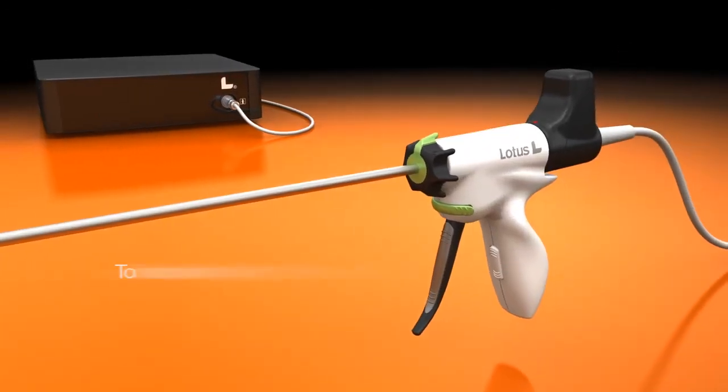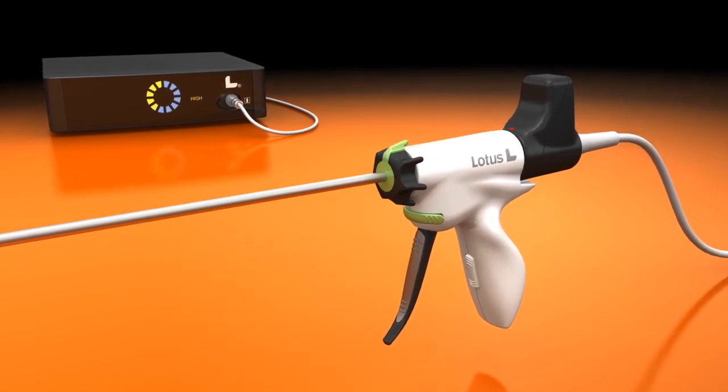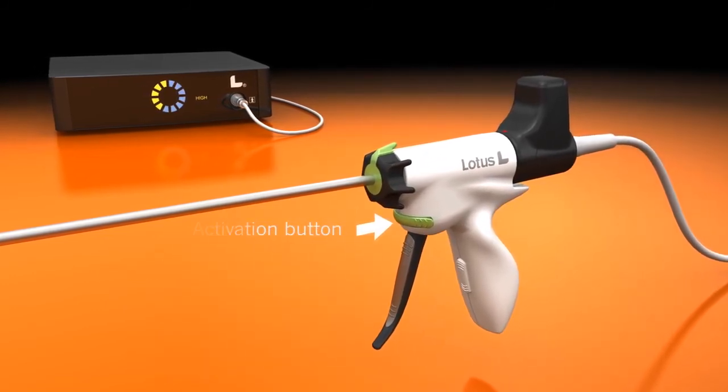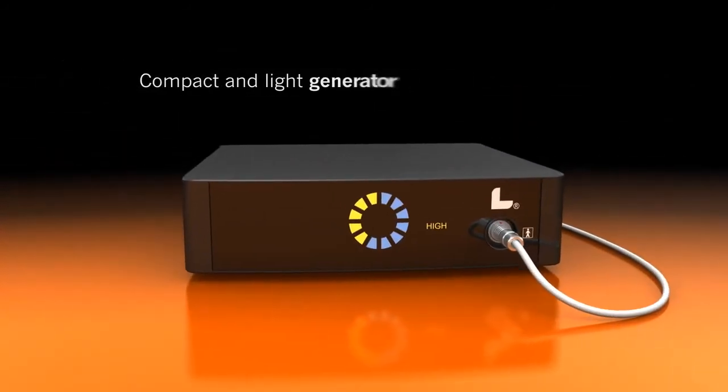To initialise the handpiece, press the power select button. The Lotus plug and play concept comprises a user-friendly instrument and a compact and light generator.